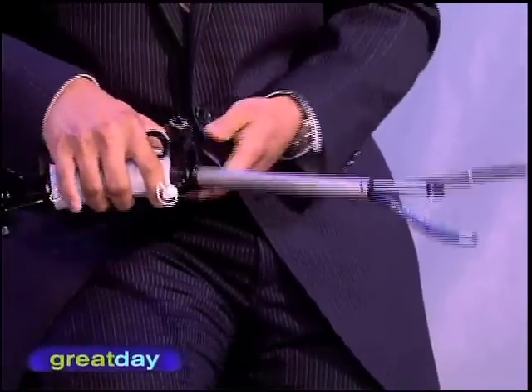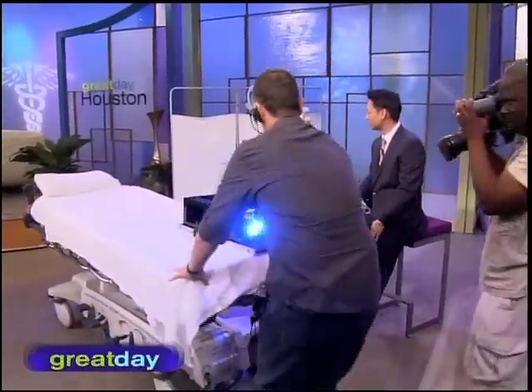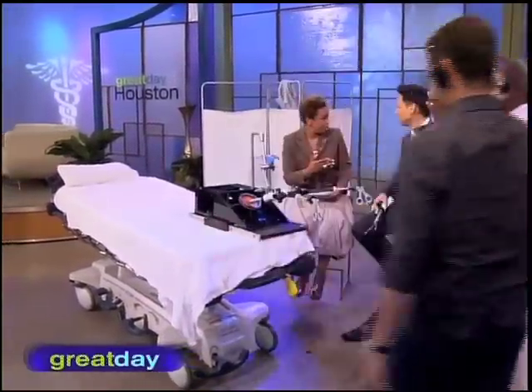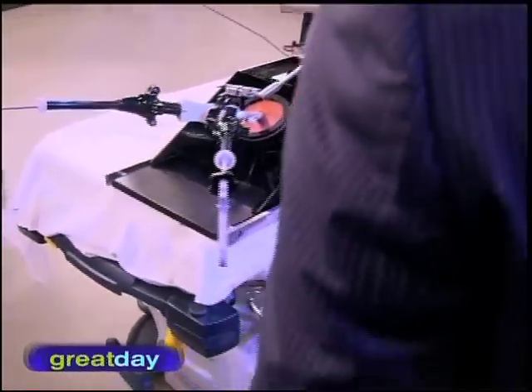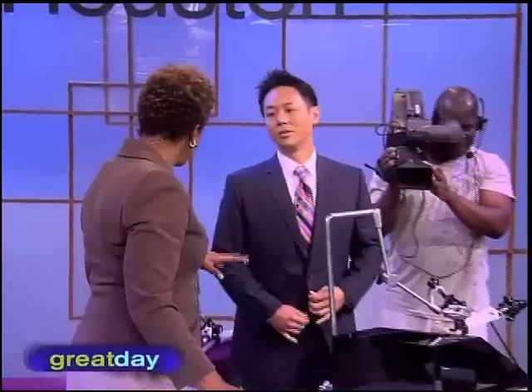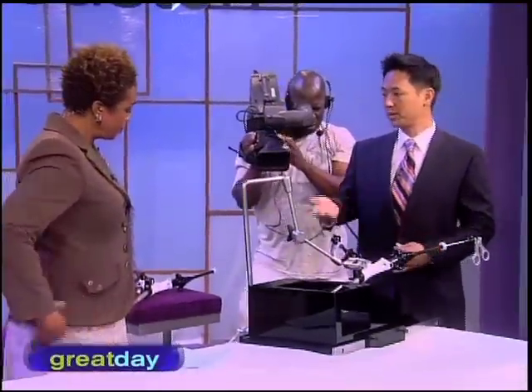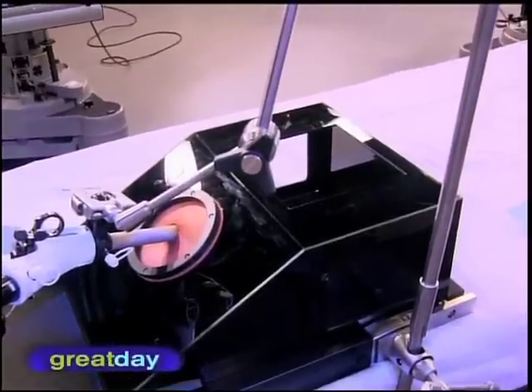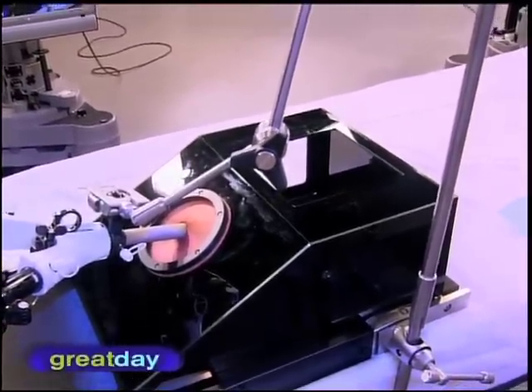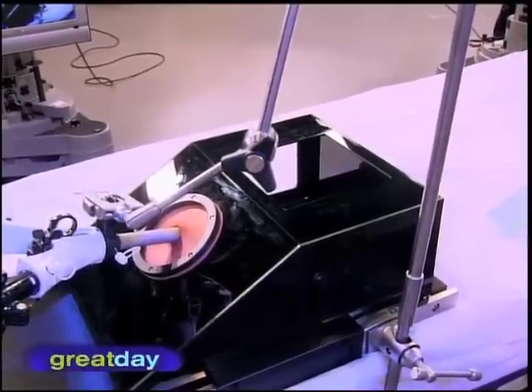Let's take a look at how this actually works. For bariatric surgery that's fantastic, and the advantage is not only the scarring, but something probably more important: reducing the recovery time. When you're able to do things through just one small incision, recovery should be quicker, people should hurt less, and obviously there are cosmetic benefits. People love being able to do things through one incision through the belly button — ultimately you're never going to see that scar.